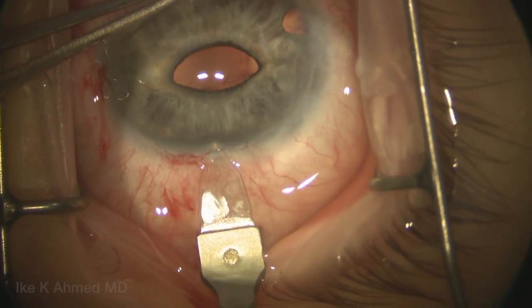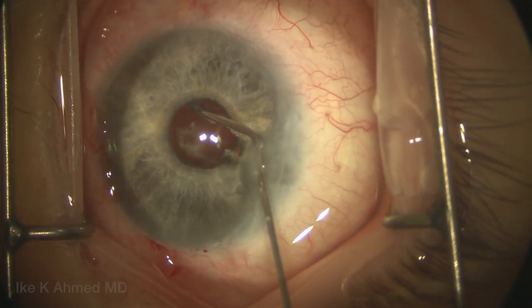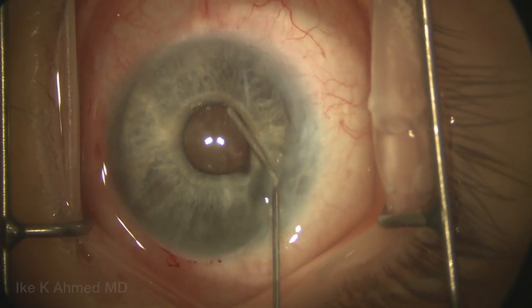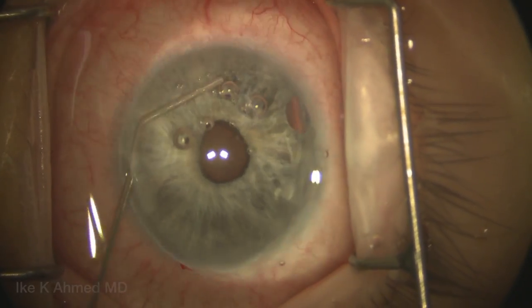We're going to now make that temporal incision at least initially at 3mm with the diamond keratome, and inject some triamcinolone again to visualize any vitreous. As you can see, there really is no vitreous present in the anterior chamber or retropupillary space. We'll then inject some Miochol, sweeping the pupil to bring it down to facilitate implantation and prevent vitreous prolapse.